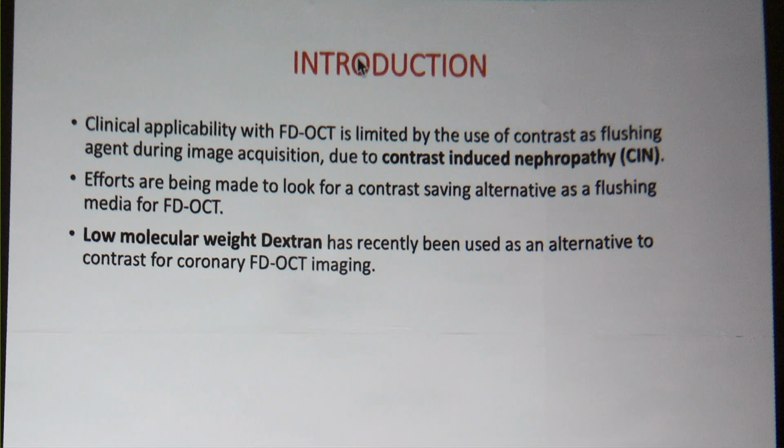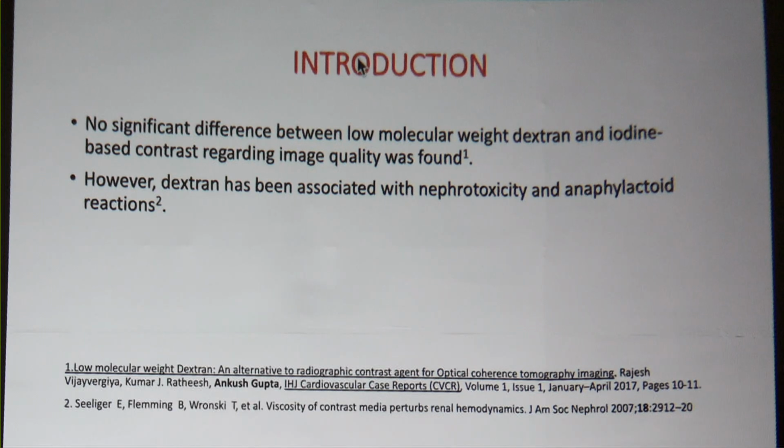Low molecular weight dextran has been used. Dr. Rajesh has published also, and in low molecular weight dextran we saw that images are as good as that of contrast, but it has its own limitations of availability, anaphylactoid reaction, and nephrotoxicity.